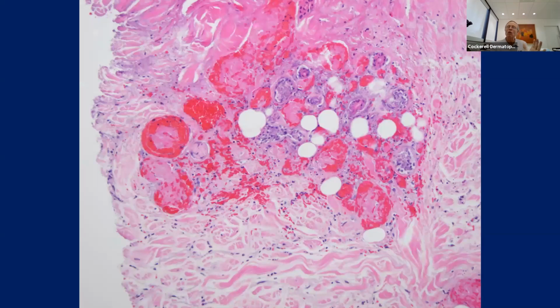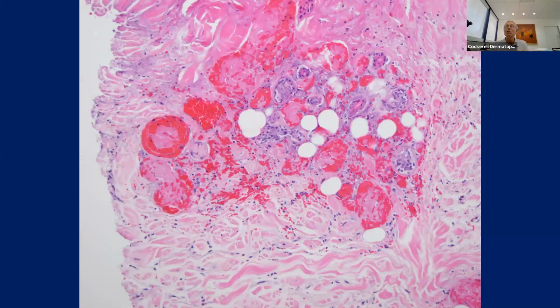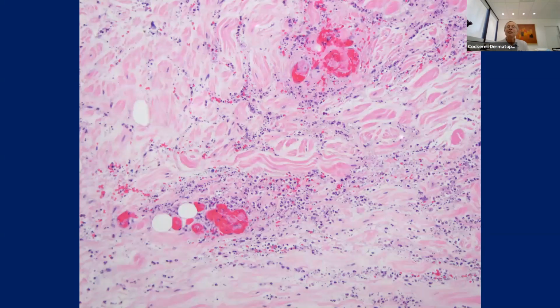It's kind of hard to see that at low magnification. When you get this extensive involvement with some infiltrate, with some polys, that's a little more inflammatory than most cryos and things like that. Sepsis is not a bad idea, but usually more inflammation than that. DIC possibly, but you have to think about one other thing today, especially when you get this much inflammation with these areas of vascular thrombosis that's killing everything.